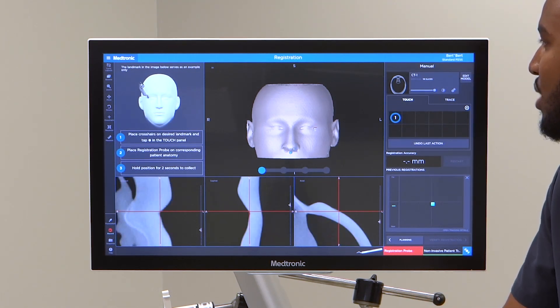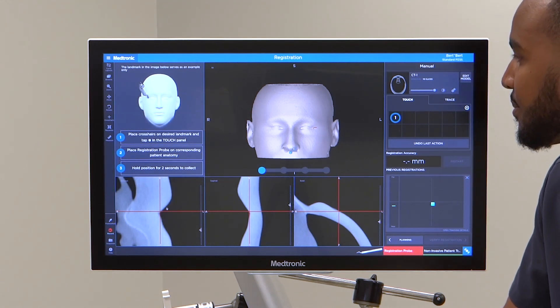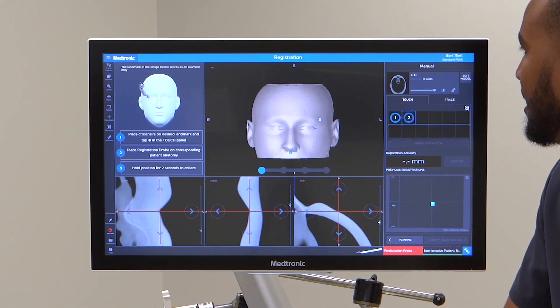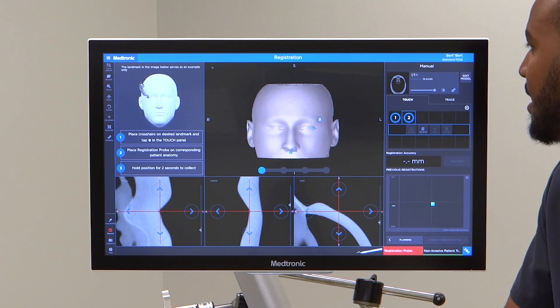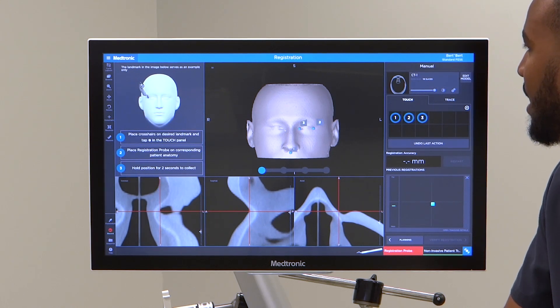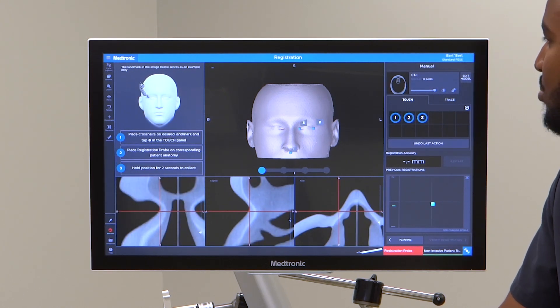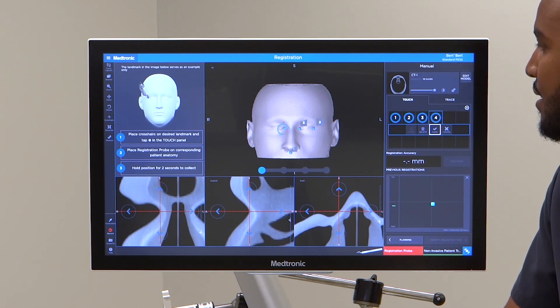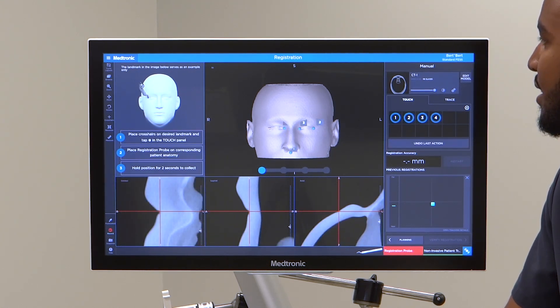You can add another point on the left side, refining that, and then adding another point, refining it. That looks good, then I'll save. Click the 3D model for another point here, add and then refine. That looks pretty good to me. And then I'll do one last point on the outer canthus on the right side.